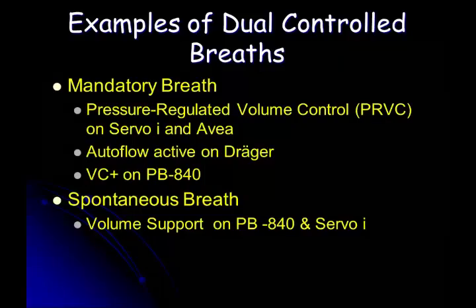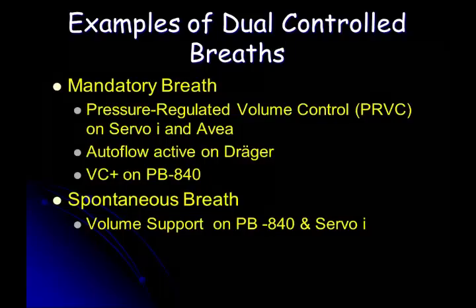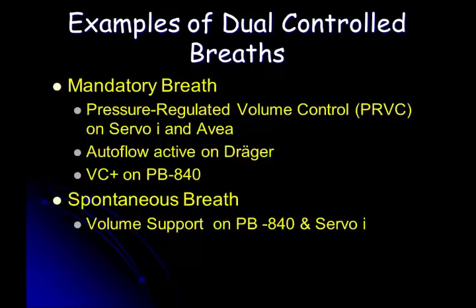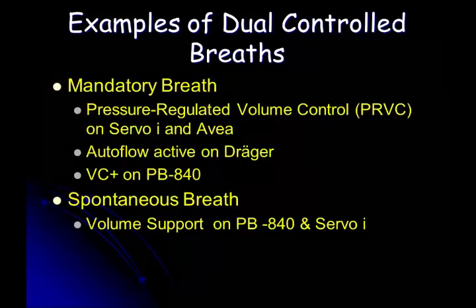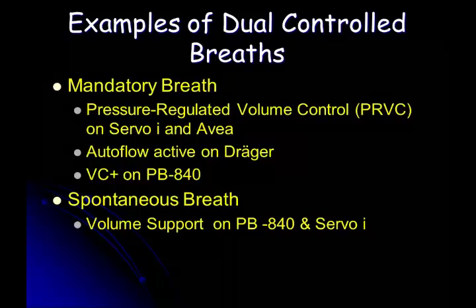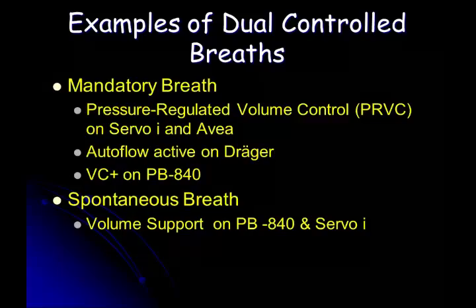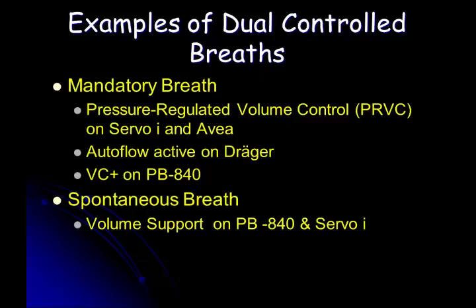In the case of volume support, yes. If it senses that the patient's tidal volume spontaneously is less than my target, it will alter the level of boost, the level of delta that it's applying to get to that point. And it does it on a breath-by-breath basis. Okay. But those are dual modes. I'm setting a target, and I'm making an alteration to get to that target.